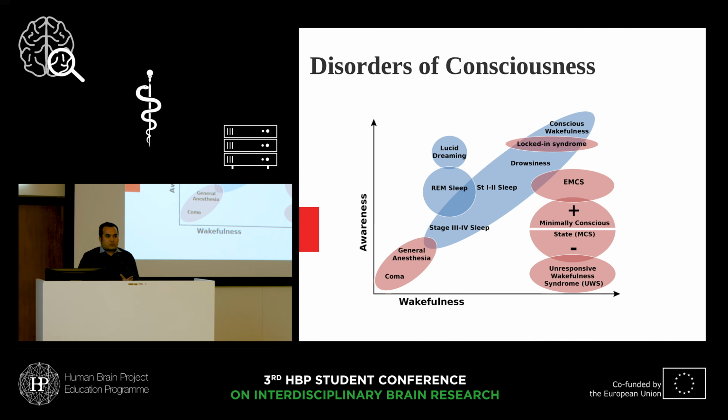There are also some other groups who are awake and aware, but because of some damage, they are paralyzed and cannot respond to us. We call them locked-in syndrome, and usually we don't consider them as disorders of consciousness. Different neuroimaging modalities have been used to study these patients. In this talk, I want to speak a little about high-density EEG and the method that we used.